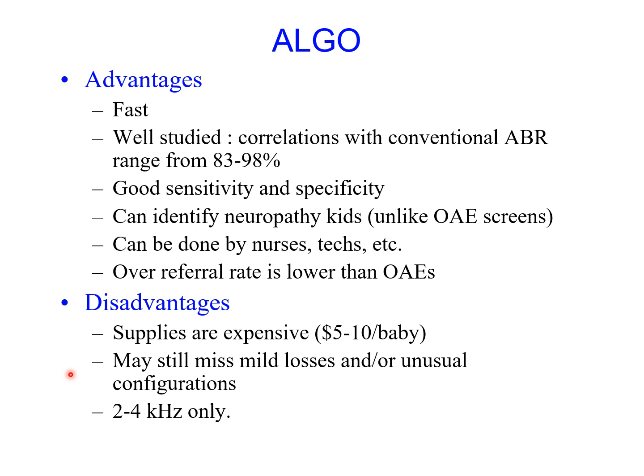Also, you may miss unusual audiometric configurations. That is because click ABRs are good only to predict the 2 to 4,000 Hz region only. So again and again, when we use click-evoked ABRs, do not overinterpret the results. It only correlates with the 2 to 4,000 Hz range only.